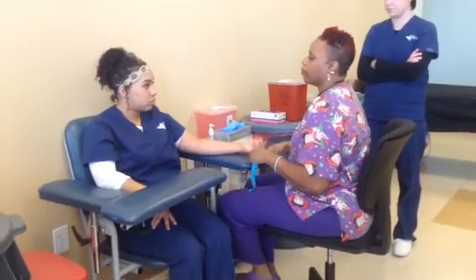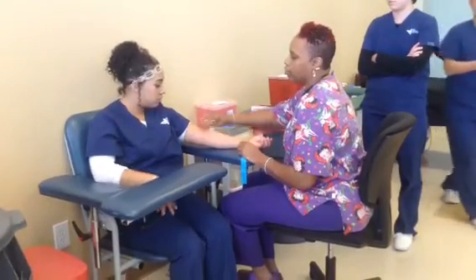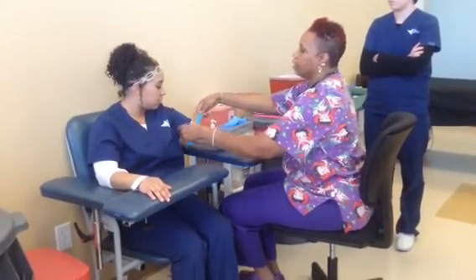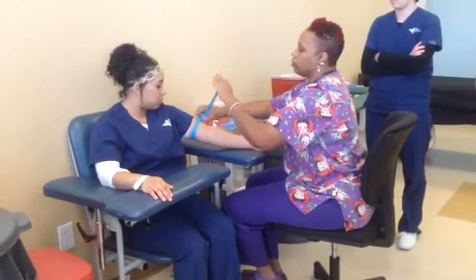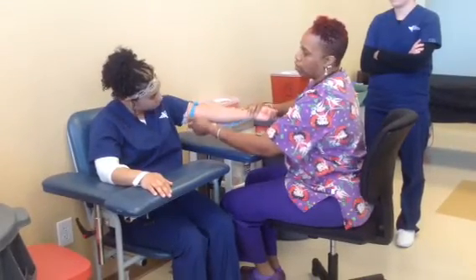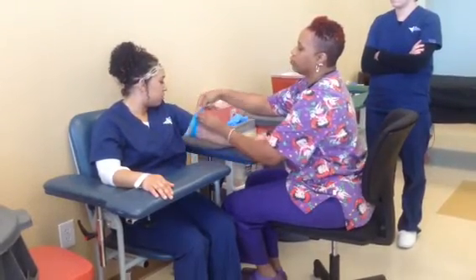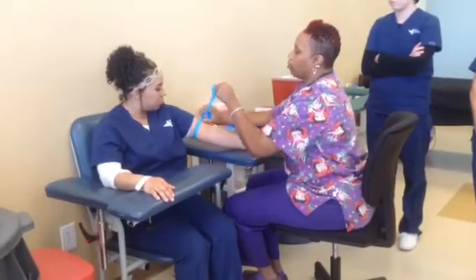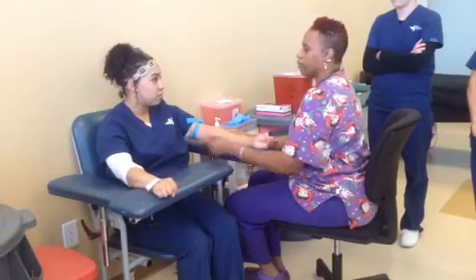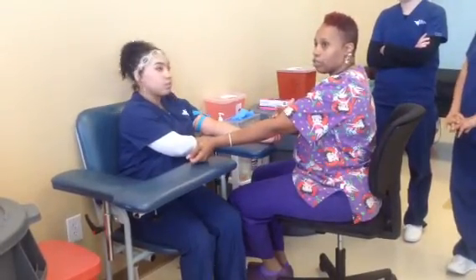She's going to give me her arm. Remember, we said we want our tourniquet to be two to three fingers above where we're going to stick. If we're sticking in the antecubital, I mark off two to three fingers, so my tourniquet should be right around here in the bicep area. We're going to pull tension and tie it like a shoe. We want to make sure there is no rolling around the arm — it just rolled, so we have to re-tie it. We don't want it to roll because it pinches the patient's skin. I'm going to have you make a fist with this arm and put it up under this elbow — that hyperextends the arm out and helps bring the vein to the surface a little bit.